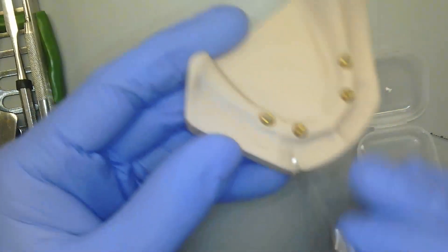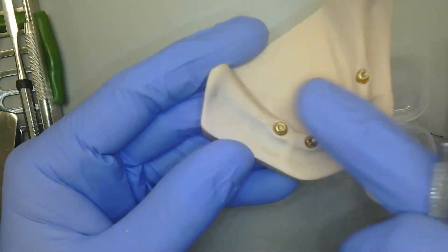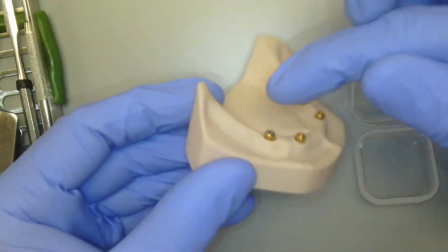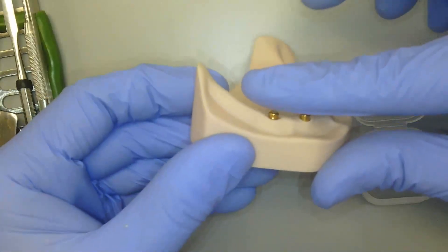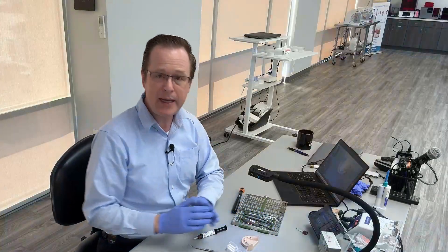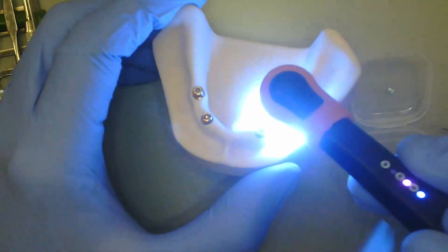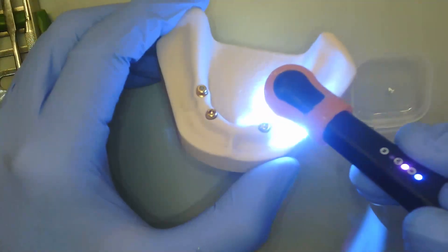I grab my little plastic instrument, take a finger swipe and barely touch it — I don't want to do a pokey finger, it's a wide finger, straight across. Once I've placed my bulk easy plus material onto my locator angled abutment, I want to let it rest for approximately 90 seconds prior to light curing, to ensure the material has had a chance to seal all the crevices and flow to ensure a really good seal. Once it's settled, I go ahead and light cure to finish the curing process.